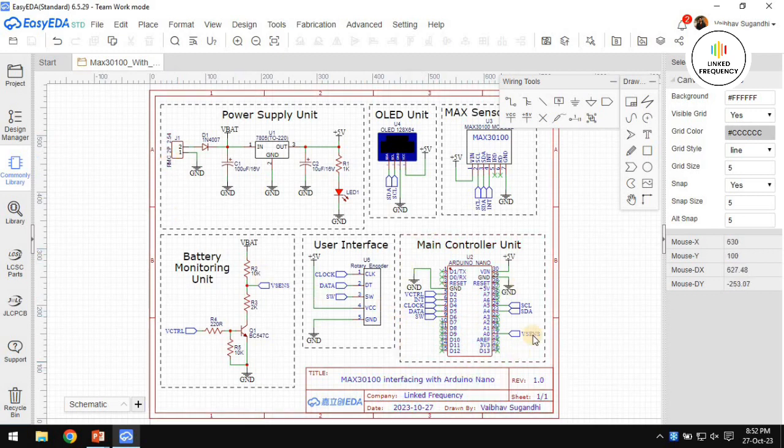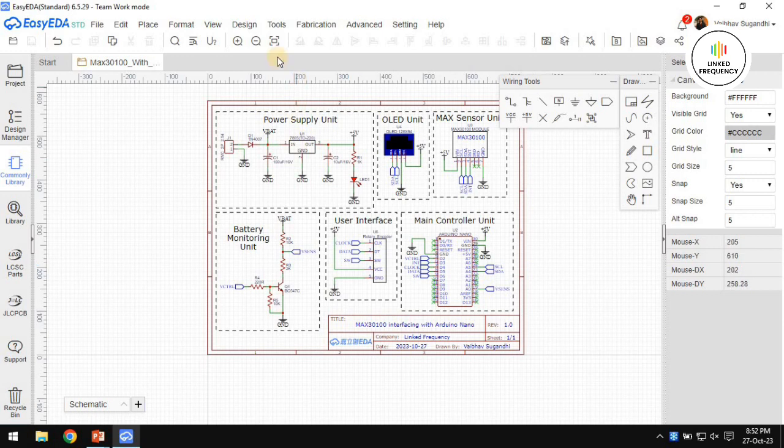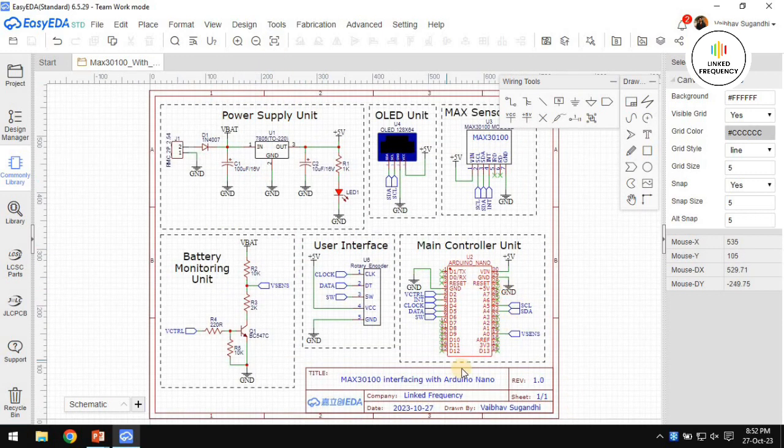And then we have our main controlling unit, that is the Arduino Nano development board. You can notice whenever I am not using any of the GPIO, we use this no connection flag. This no connection flag is to be added on the pin where it is not used. When we are not using any one of the pins for any microcontroller or component or development board or anything, you just make sure that you add a no connection flag. That will indicate to the software that I'm not using that particular pin purposefully. I have not left it unintentionally or unknowingly. That is the indication for the software.